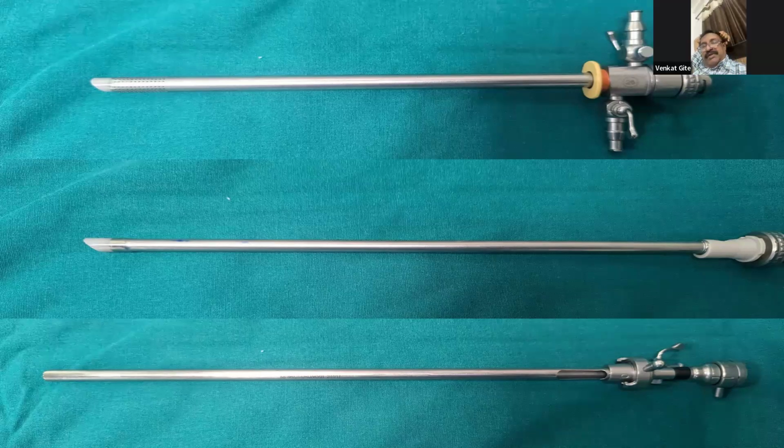The key point that Pankaj sir has told is low pressure. That is very important. So the Iglesias system is continuous, simultaneous irrigation and suction, keeping intravesical pressure low.